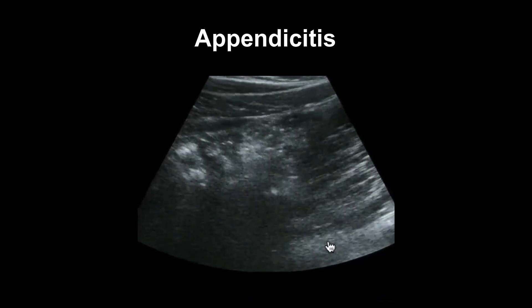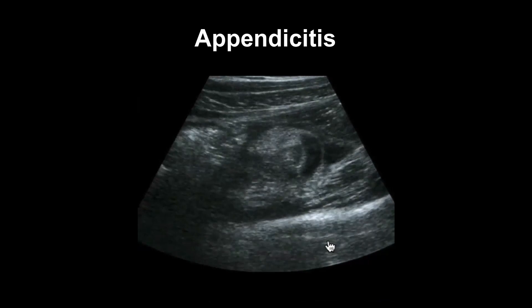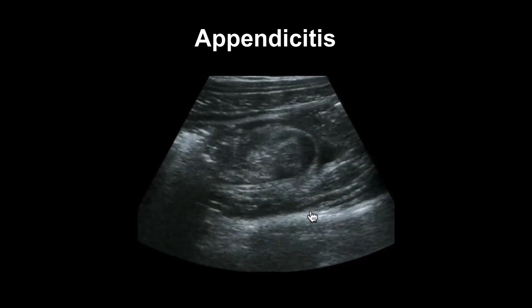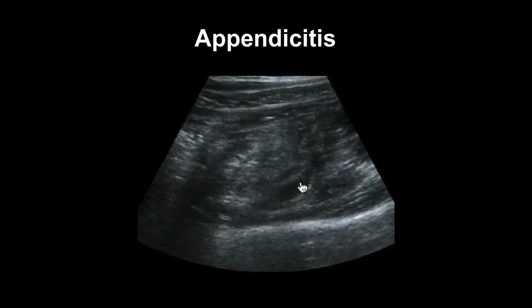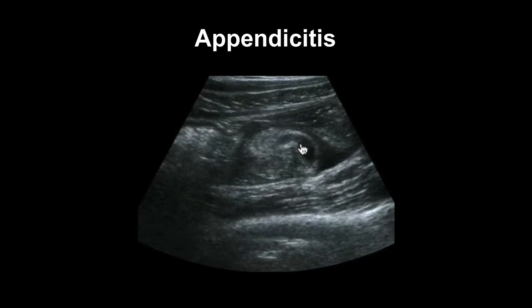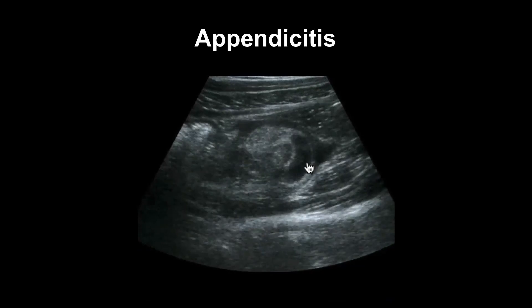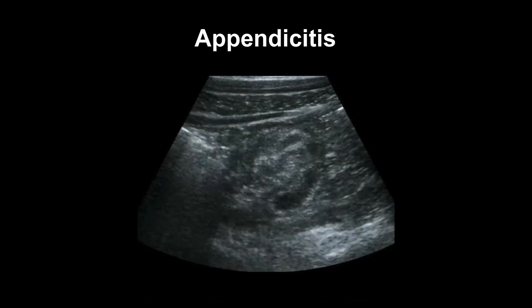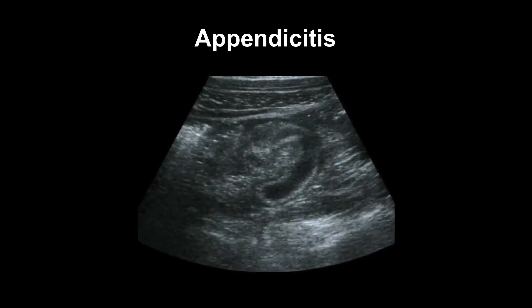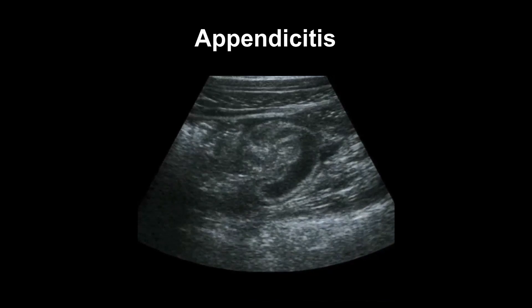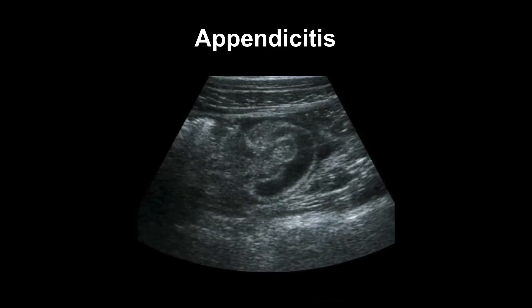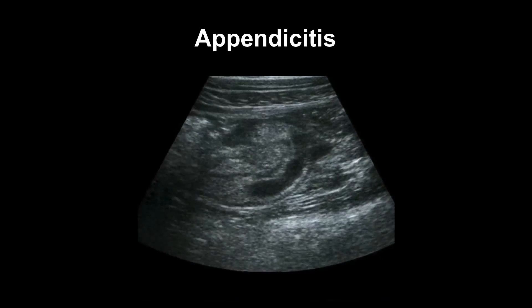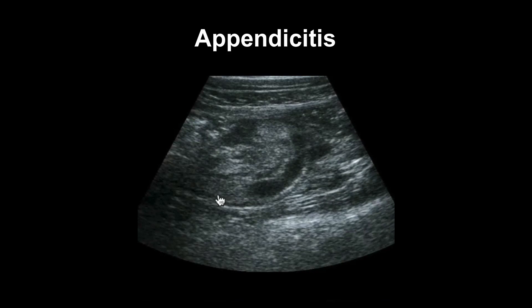Now we go into a long section over the cecal pole and we see the dilated appendix coming out here and moving behind the cecal pole. This is the typical presentation of appendicitis.